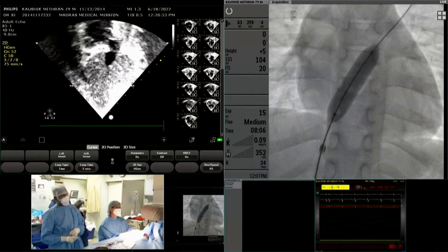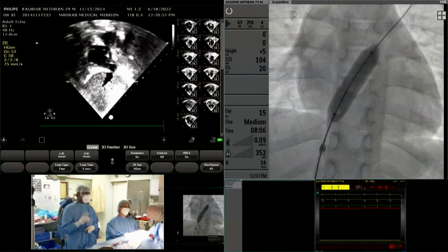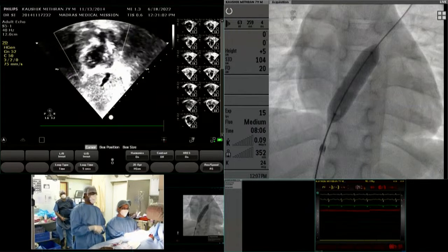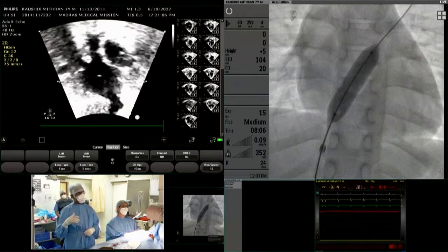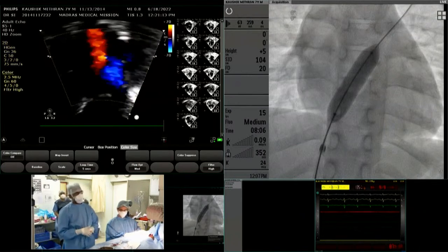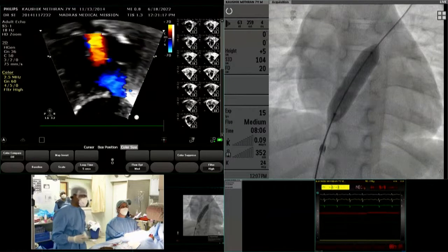Is prone for polycythemia and polycythemia related complications. Is prone for paradoxical embolism. So in every patient where the right heart is reasonably able to take the load of the systemic veins, we should allow the systemic veins to go through the pulmonary artery and not allow a right left shunt. Risk of paradoxical embolism plus risk of, Pramod, I have not deflated the balloon.